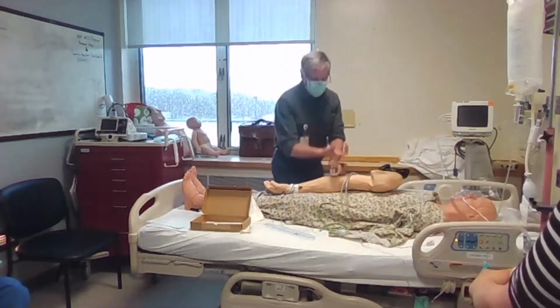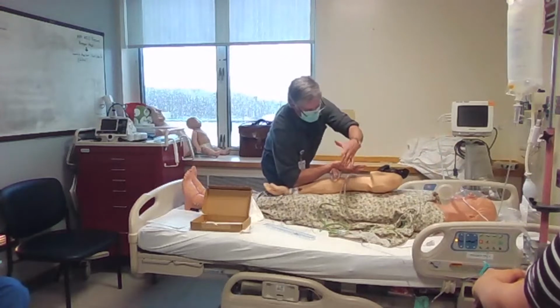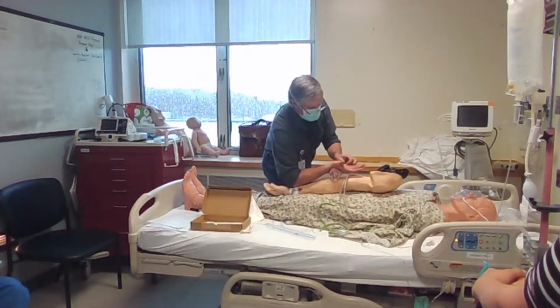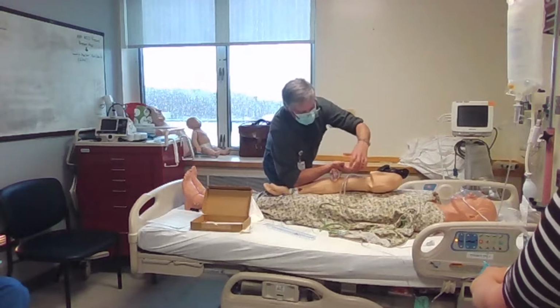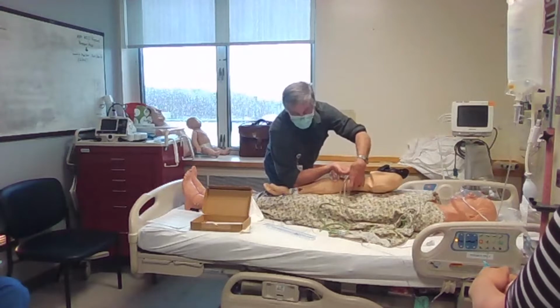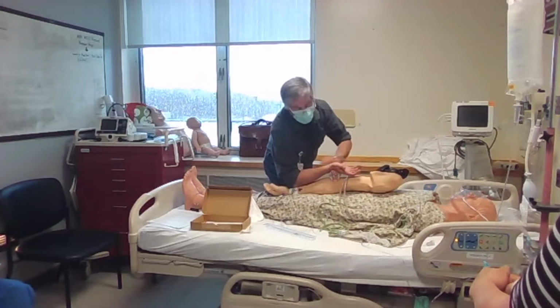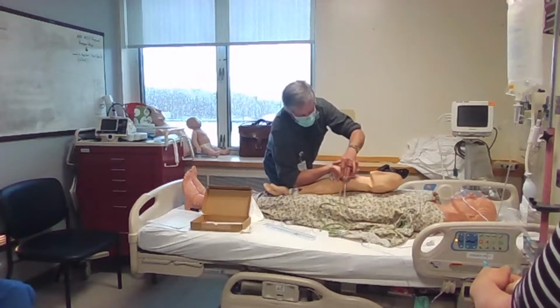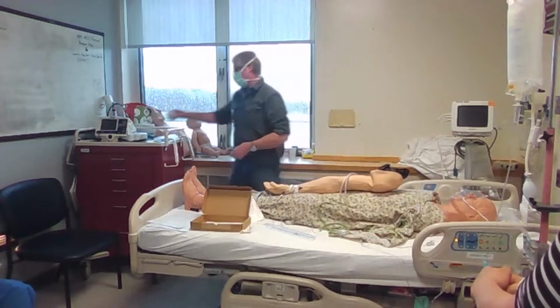This will work. So something rolled like that, you put it underneath the arm, and then you tape the hand down. So you take tape and you tape it to either the bed or a board on the side, and you run the tape across the palm, around whatever you've got or what you want to stick it to. And you take the thumb and you tape the thumb down like that as well, because the thumb's going to get in your way when you're trying to work here. So you tape the thumb down, it gets it out of the way, but it also tenses up that skin more. So it makes it easier to perform the procedure.